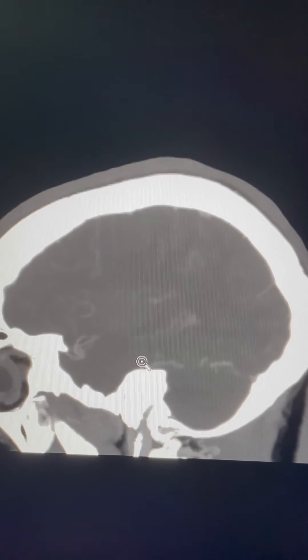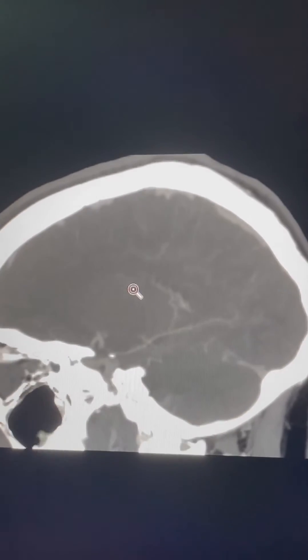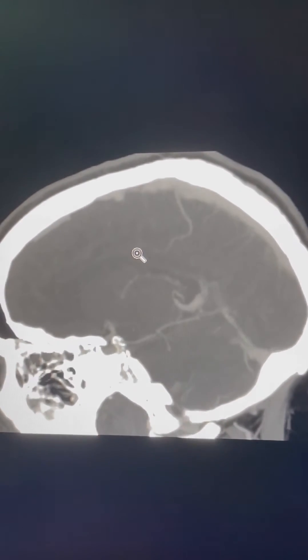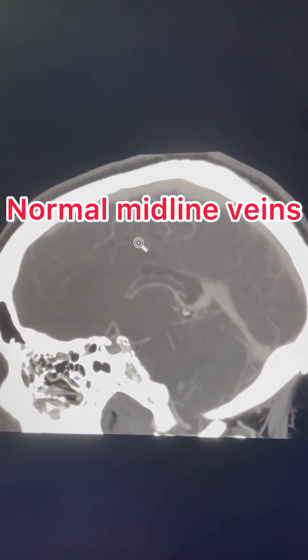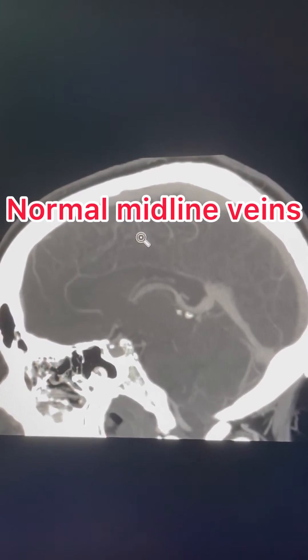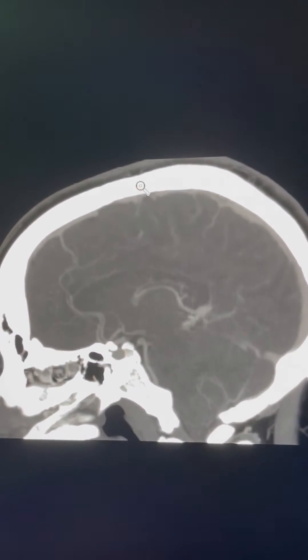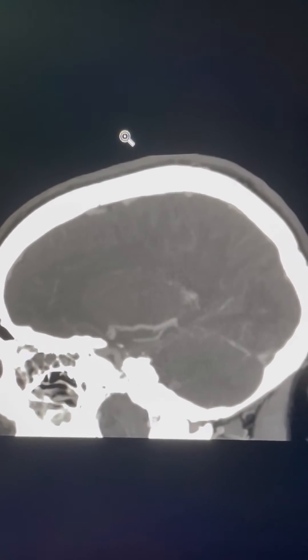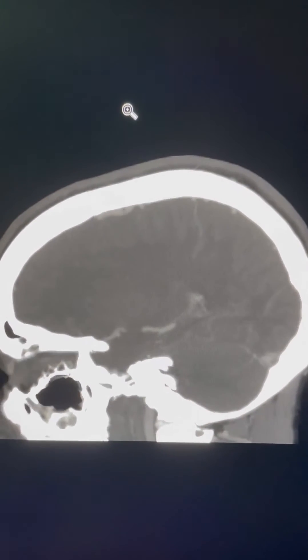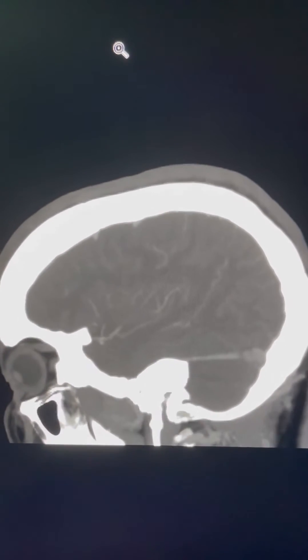Now we will look at the sagittal view to assess the midline veins and major cerebral veins. They show normal filling. After looking at the sagittal view, we will move to the coronal view.